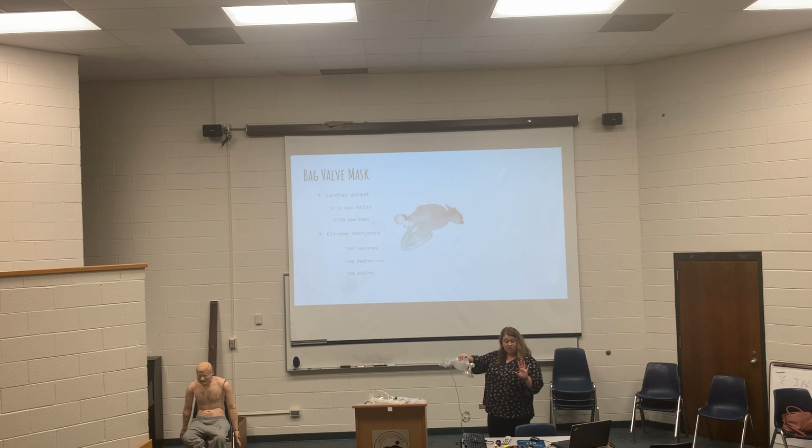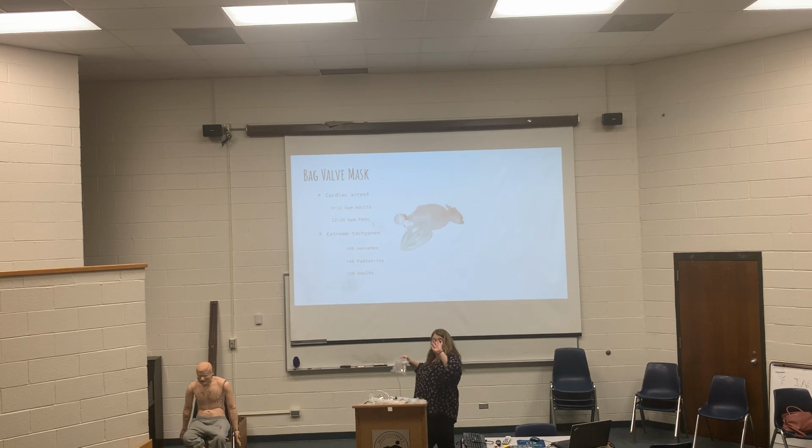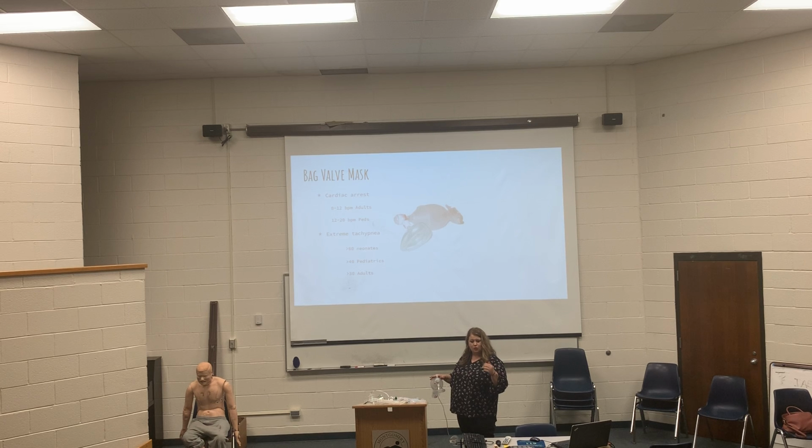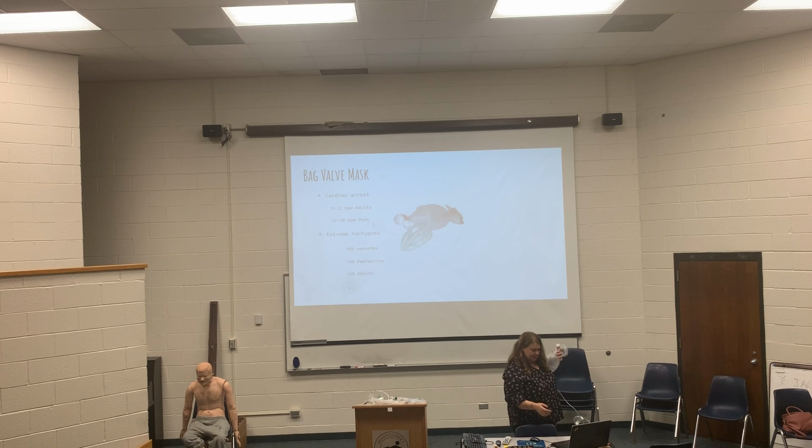You don't want to do it too much, because then you're pushing all that air into their stomach, and then they get that gastric distension, and then I am gonna pop over there with that NG tube, like we did the other day, like you saw me do, and you have to release some of that gastric distension. So you only want to do about half to 3/4. You don't want to do it too fast, but you don't want to do it too slow. You'll kind of get the rhythm. But look at that CO2, that's an excellent indicator.